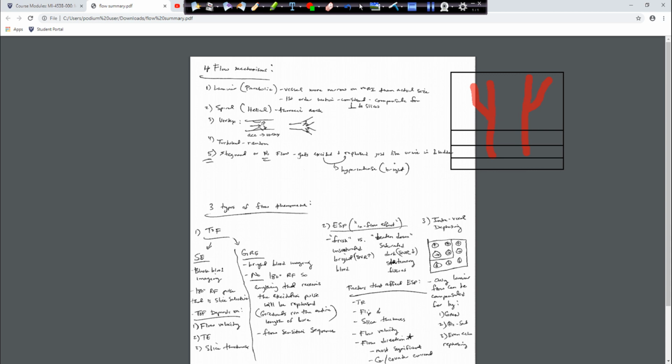Today we're going to be talking about how sometimes we're going to be imaging slices or blood that is going to be in-plane with the slice. And we're mainly describing our circle of Willis, because our circle of Willis has all these twists and turns. It's not as straight as our carotid arteries, so we're not really going to be imaging using a 2D sequence where we're getting slice by slice. We're actually utilizing a whole 3D slab to image that type of blood flow, which has more twists and turns.